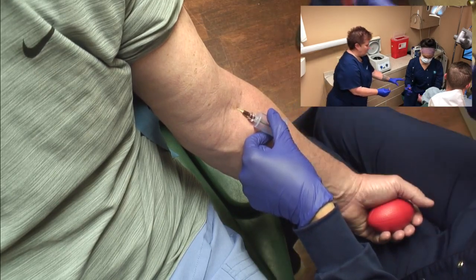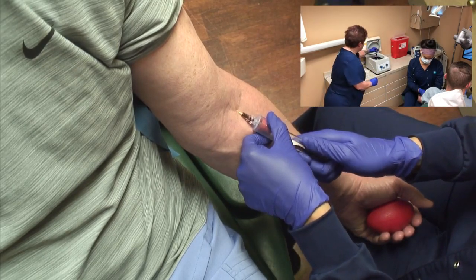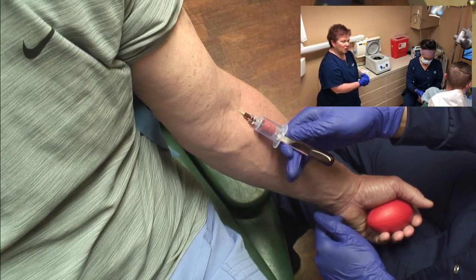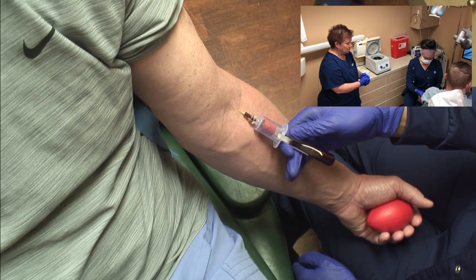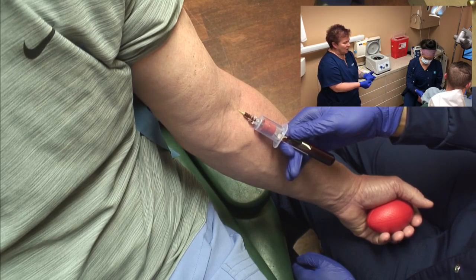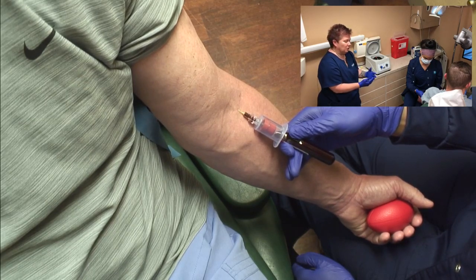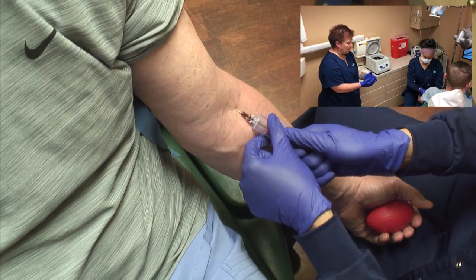So then it's key. You can see how China has a firm hold on the Vacutainer holder. That's key to maintaining your flow and not bending your catheter. Some other things that we found is if you don't get that Vacutainer holder tightly on the catheter, you get some bubbles. Kind of a small little study we've done here in the office, we feel like we don't get as good of a PRF when we see the bubbles.